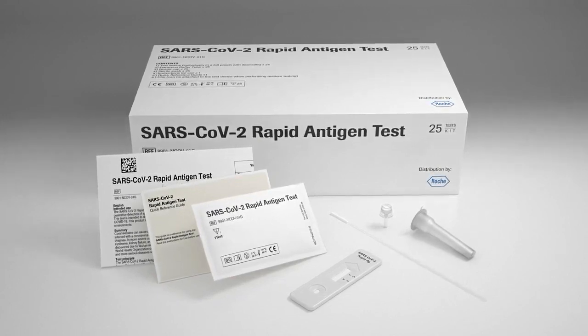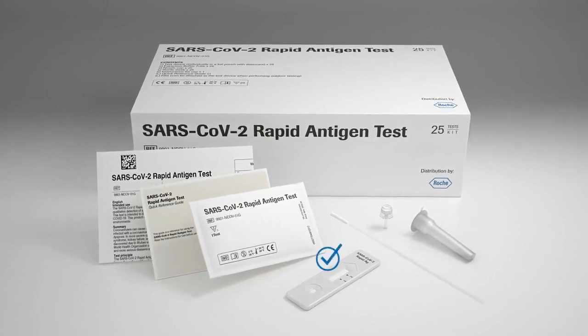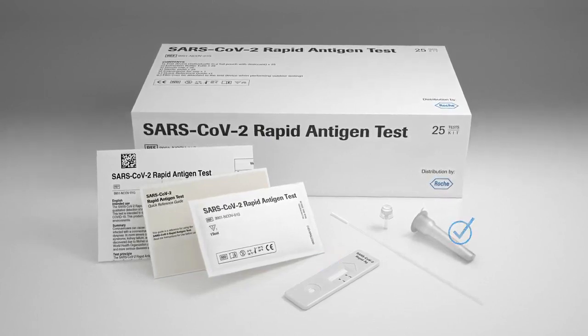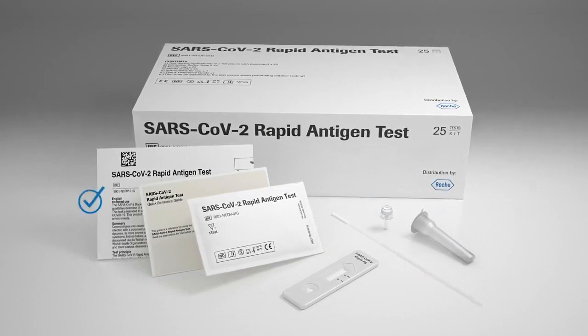The test kit is ready to use by healthcare professionals and consists of test devices, extraction buffer tubes, nozzle caps, sterile swabs, instructions for use, and the quick reference guide.